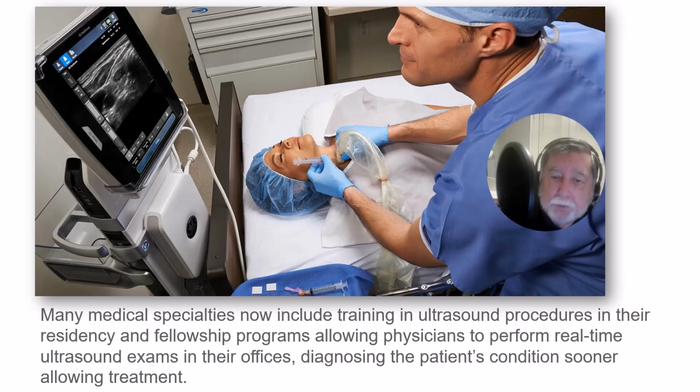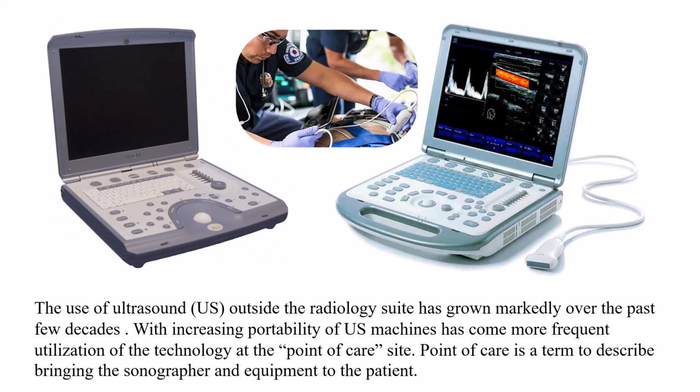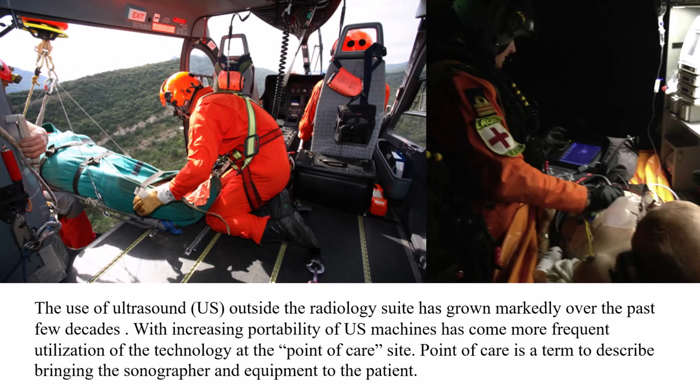Understanding ultrasound physics is crucial for physicians performing ultrasound examinations, whether in primary care, surgery, or emergency medicine. It ensures accurate interpretation and safe use of this valuable diagnostic tool. The use of ultrasound outside the radiology suite has grown markedly over the past few decades. With increasing portability of ultrasound machines has come more frequent utilization of the technology at the point of care site, or where the patient is located.